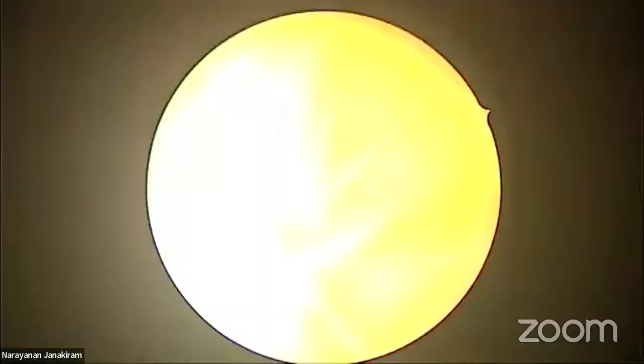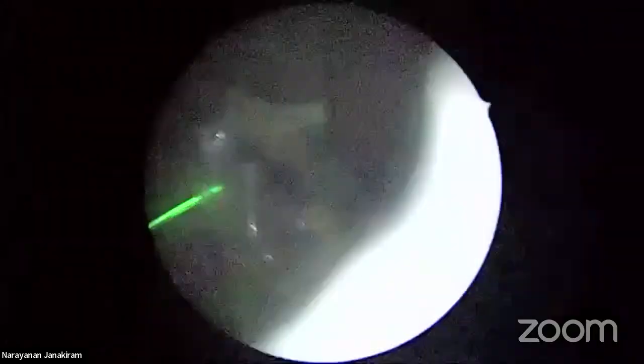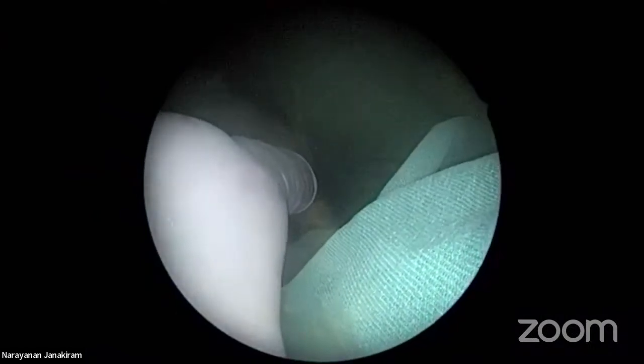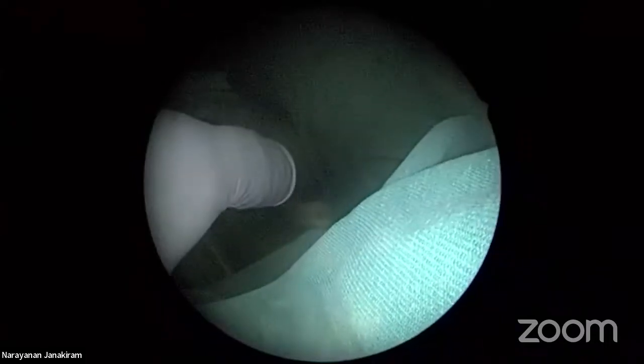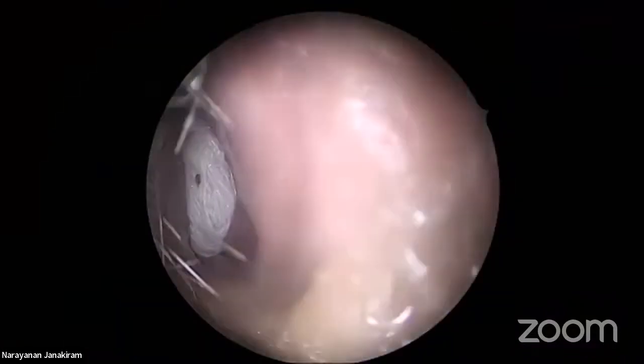I'm trying to pack as much. How many packs? Just have a count. Okay, I'm going to wait for just a minute and then get the nasal infant feeding tube catheters. Okay, right. So this is the infant feeding tube. Have you seen this? Now, what I will do is, get the adenoid blade and the mouth gag.